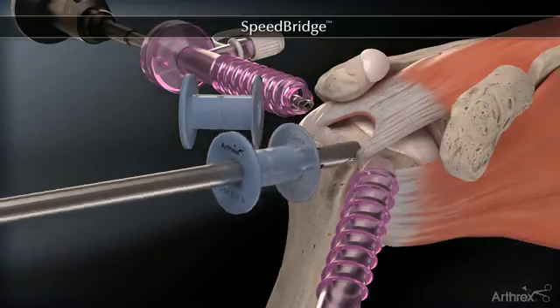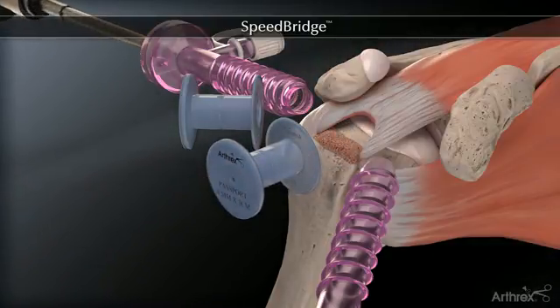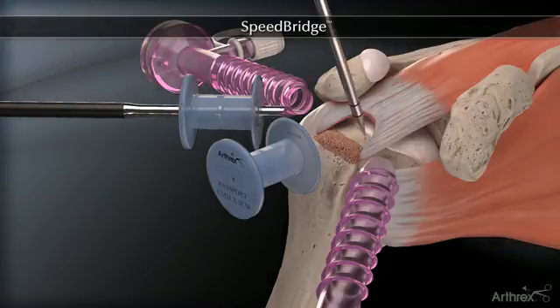The rotator cuff footprint is prepared. The Arthrex sheathless arthroscope is moved to a posterolateral viewing portal and a bone socket is prepared at the articular margin.